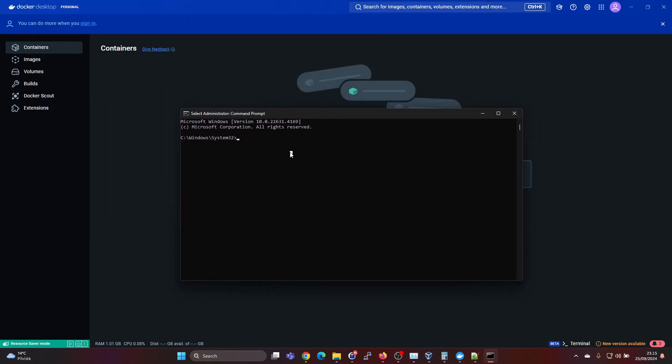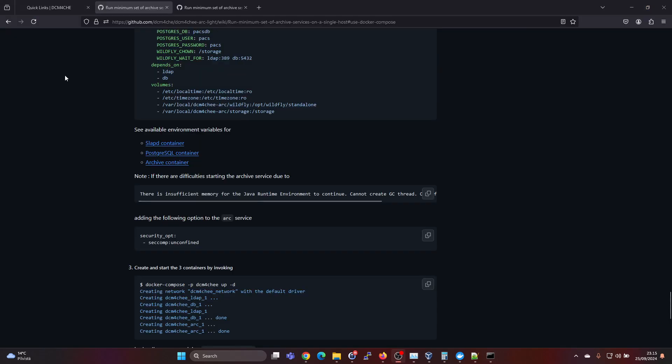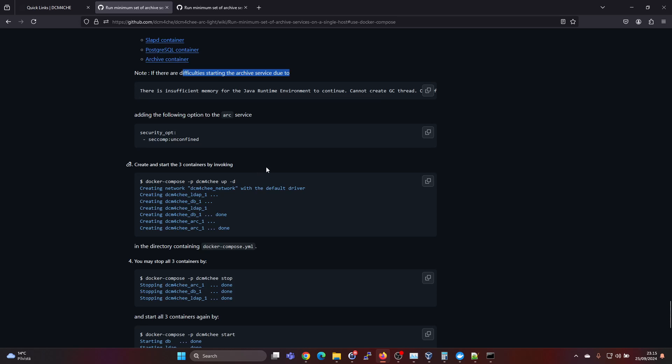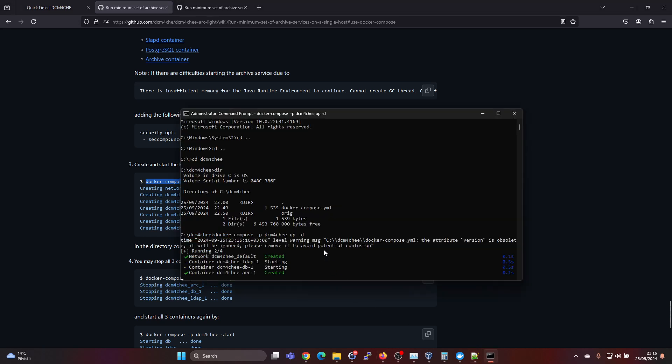And let's navigate to the folder we created. So we have dcm4chee here. And we have the file Docker Compose YAML here. You can also see there are a few troubleshooting tips here if you run into issues. But I just tried the installation before and it worked fine. So no problems in this Windows 11 environment. So create and start the three containers by invoking docker-compose -p dcm4chee up -d. So let's just copy this command here. Go in here and give it a command.